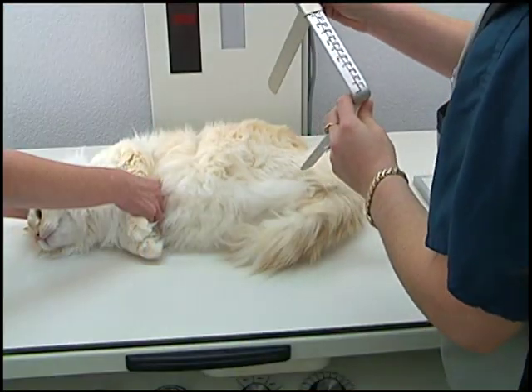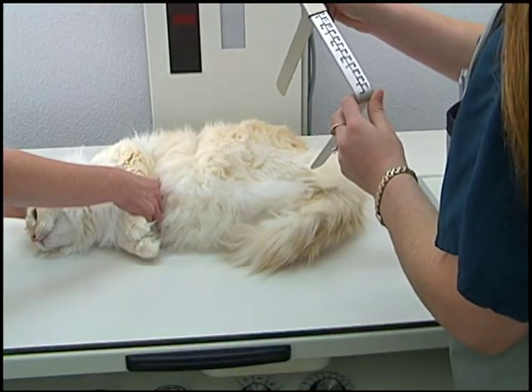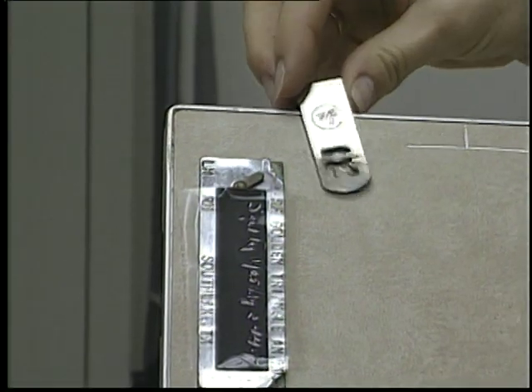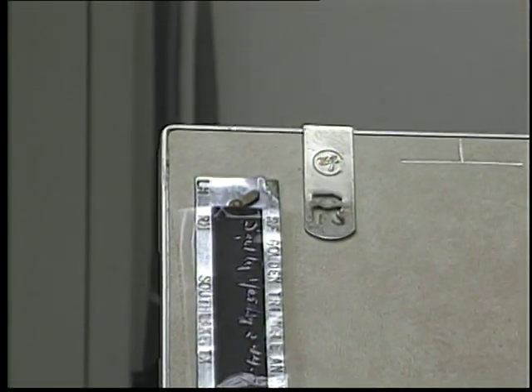A right lateral radiograph is taken with the animal lying on its right side. The radiograph is marked with an R to denote the animal's right side is closest to the film. It is important that the animal in lateral recumbency is lying parallel with the table when the exposure is made. This may require adjusting the animal's position so that the dog or cat is not angled.